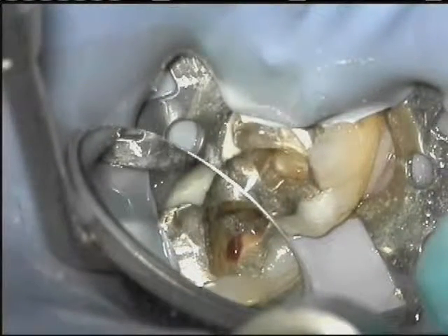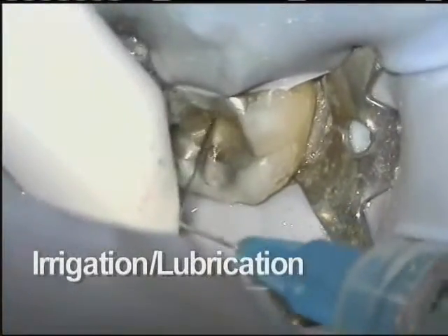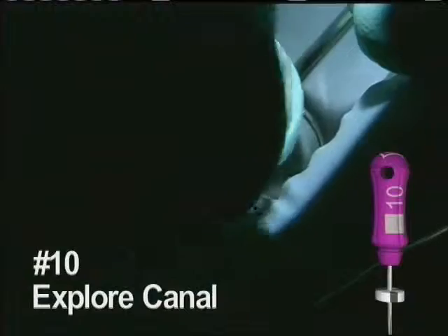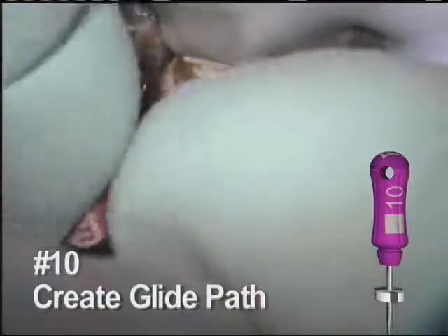Once a straight line access has been established, thoroughly irrigate and lubricate the space. This is recommended after every rotary file. Begin with a number 10 hand file. It doesn't take long to scout the canal space. This is worked to about 2/3 of the estimated depth of the canal.